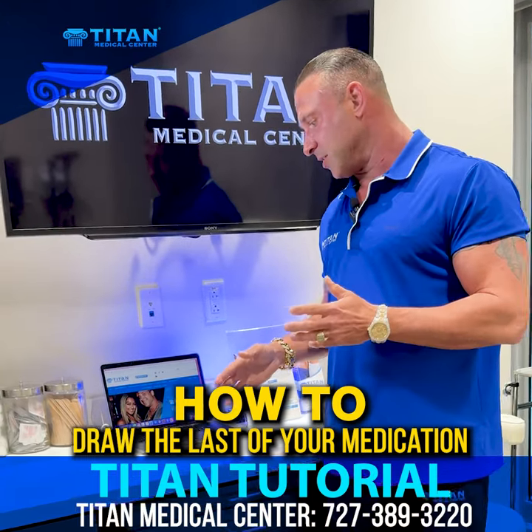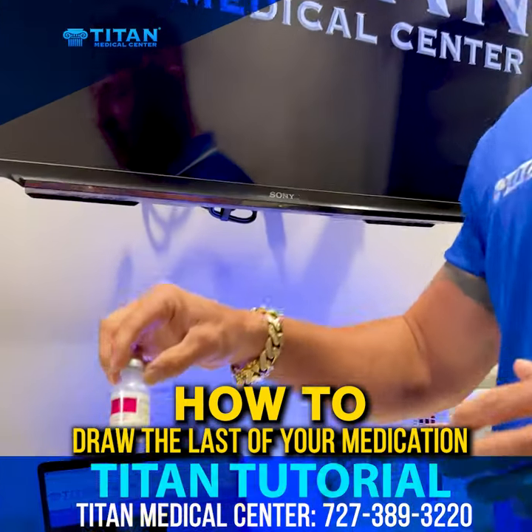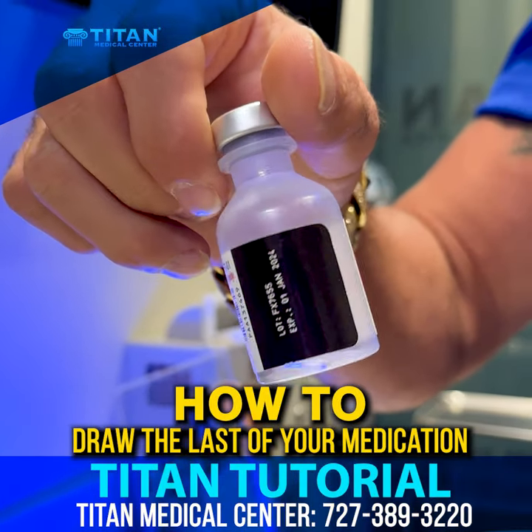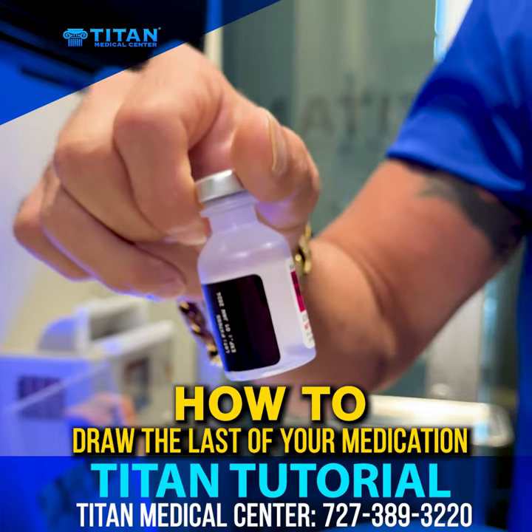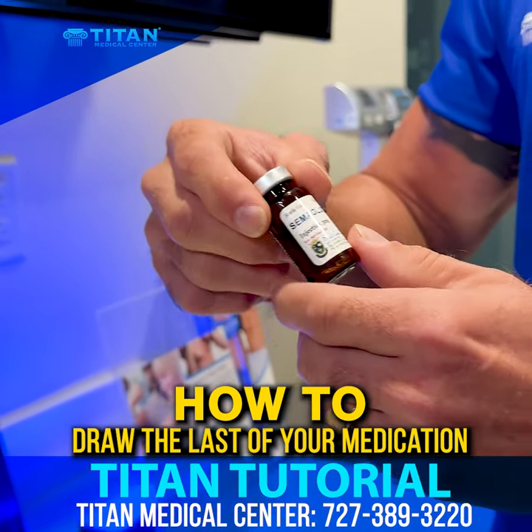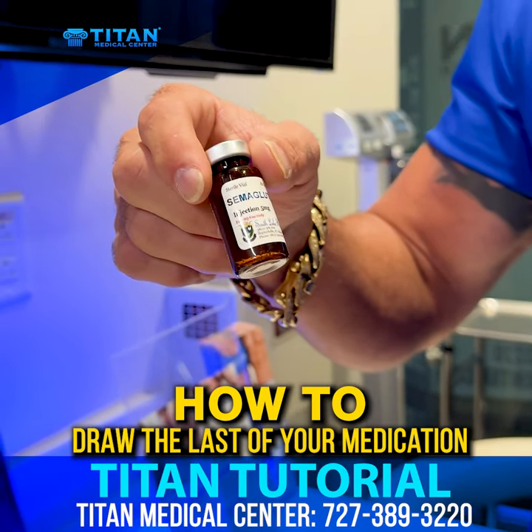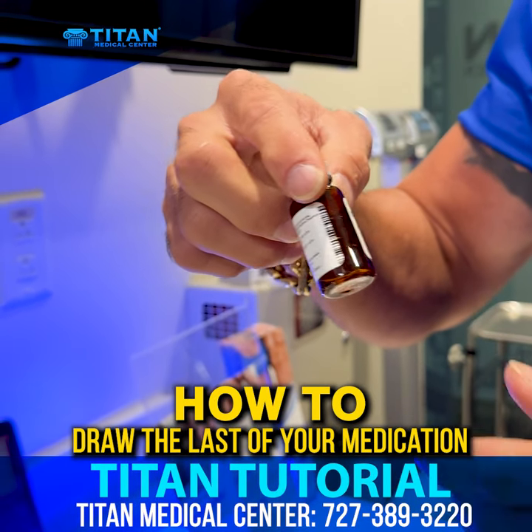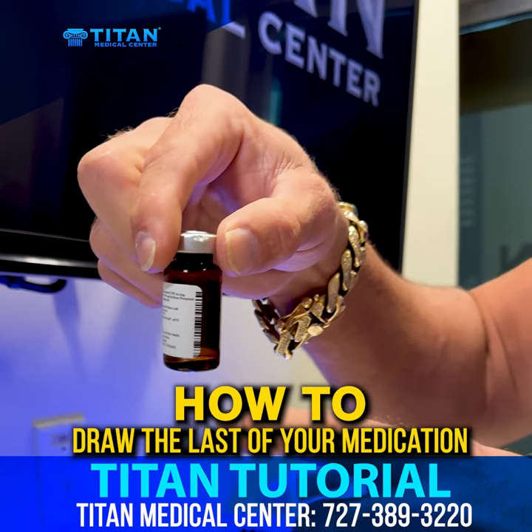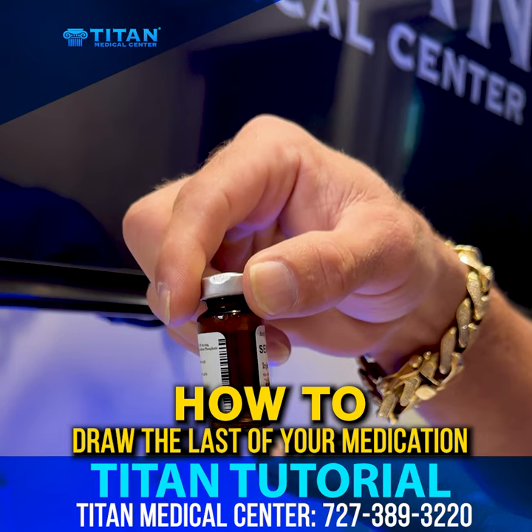So we're gonna go over two different vials today. One I have is just a regular bacteriostatic vial — you're not gonna have to really worry about this, but the reason I picked this is because it's clear and you guys can see transparently through. The next one is gonna be real usage — semaglutide. There's only a little bit left and it's in an amber vial, so we're not gonna see through it as much, but you will be able to see enough to see what we're doing.